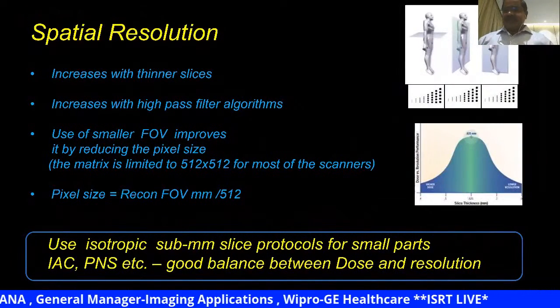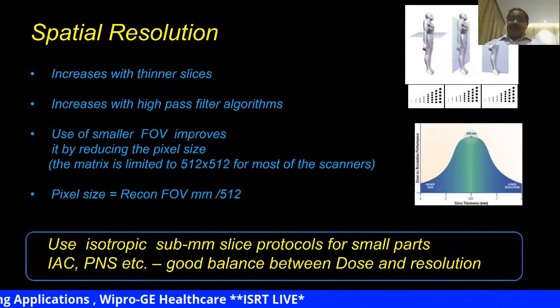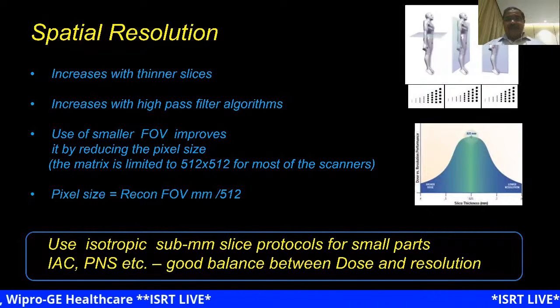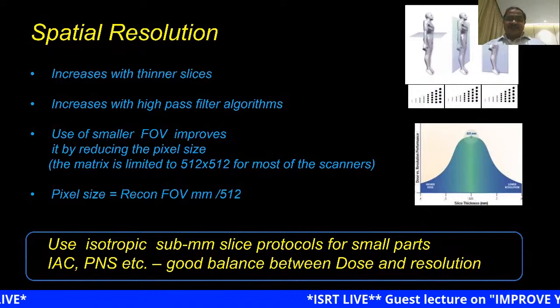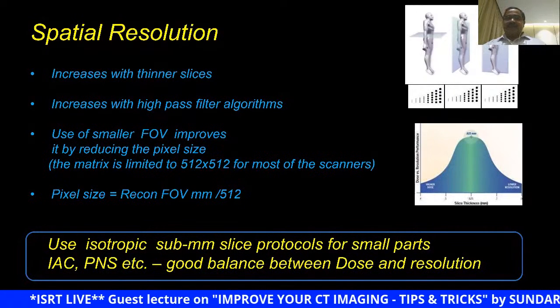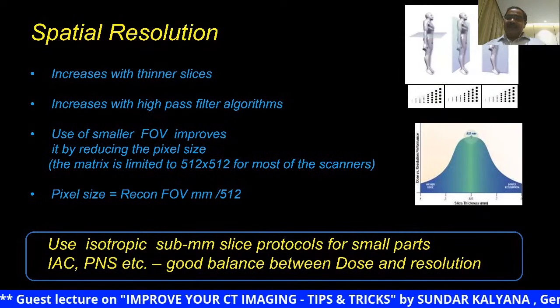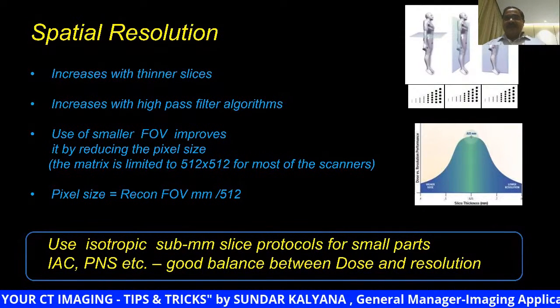Another parameter which makes a lot of quality difference in your day-to-day life is spatial resolution. Knowingly or unknowingly, we do select the protocol which is appropriately set in the system, and then use those parameters to get the right spatial resolution.